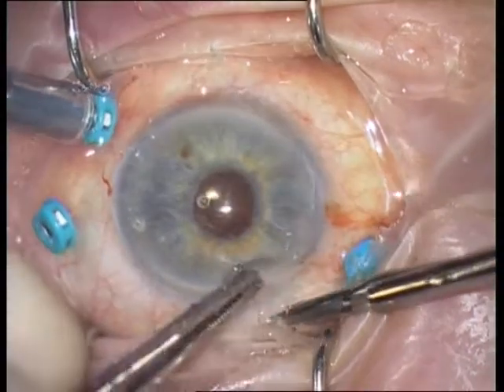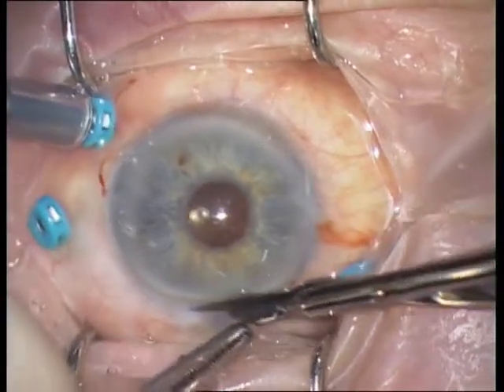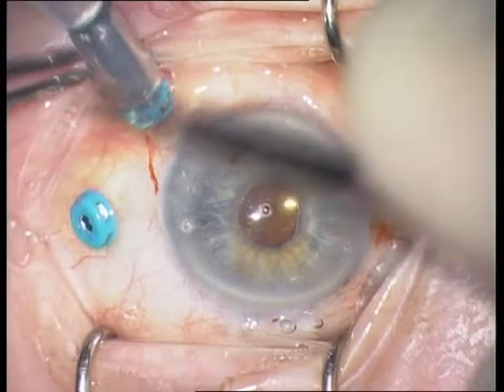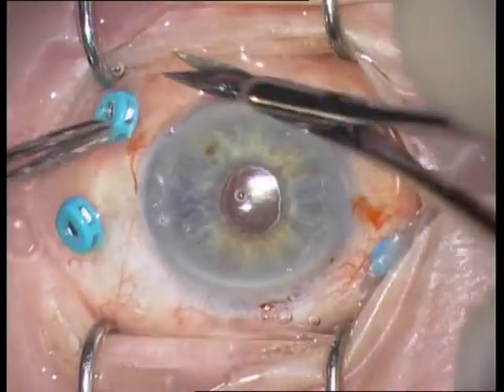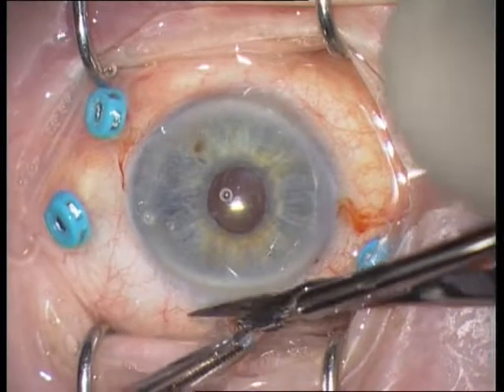This 87-year-old female was admitted with a subluxated nucleus in one eye and a subluxated IOL in the other eye. I will show here the surgery of the subluxated IOL.